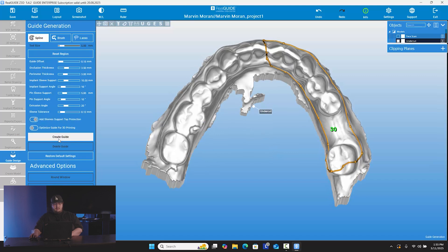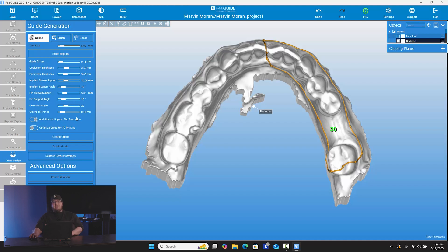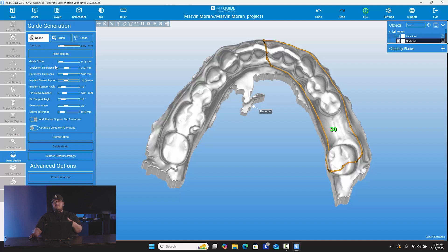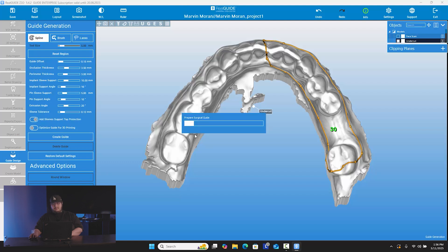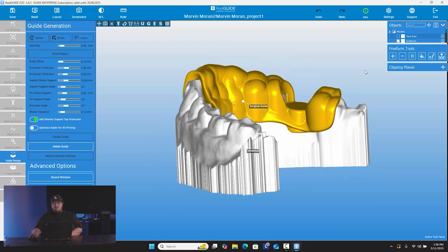Once you've drawn your representation of the guide where you want it to sit, you can go ahead and choose 'Create Guide' right here. Just before we do that, all these parameters that are set — I don't change them. But if you wanted to change the thickness, occlusal thickness, pin sleeve support, or support angle, you can. I keep it set at the exact same because everything they have here is perfect. It doesn't make them too thin, it doesn't make them too bulky, and there's still a lot of support and strength. So we're going to go ahead and just choose 'Create Guide.' It should take nothing but about 10 seconds — maybe even less. And as you see here, here's our guide made, just like that.